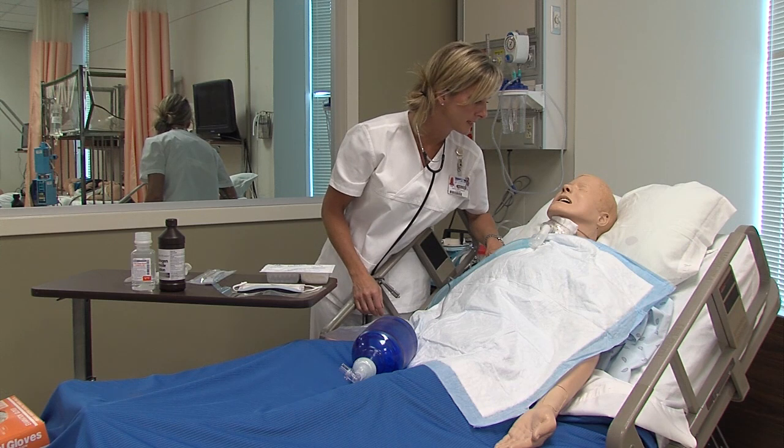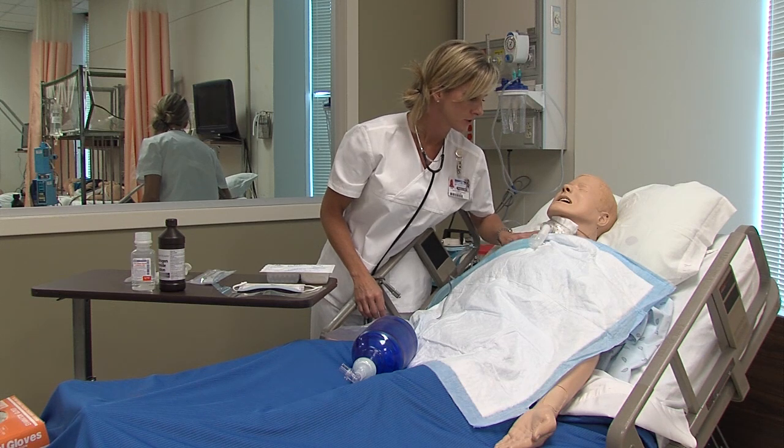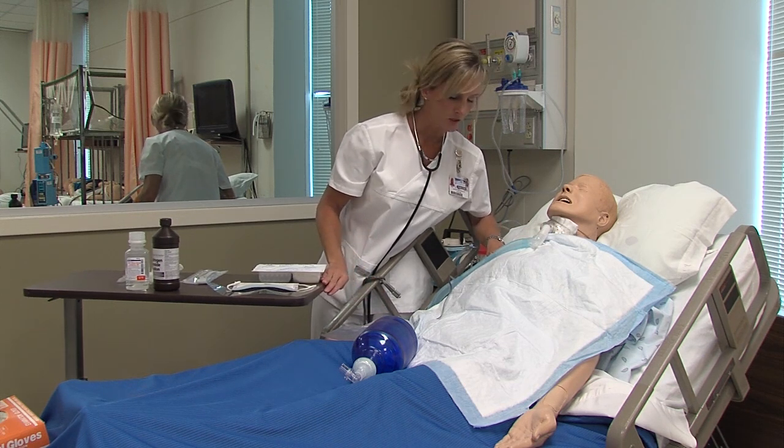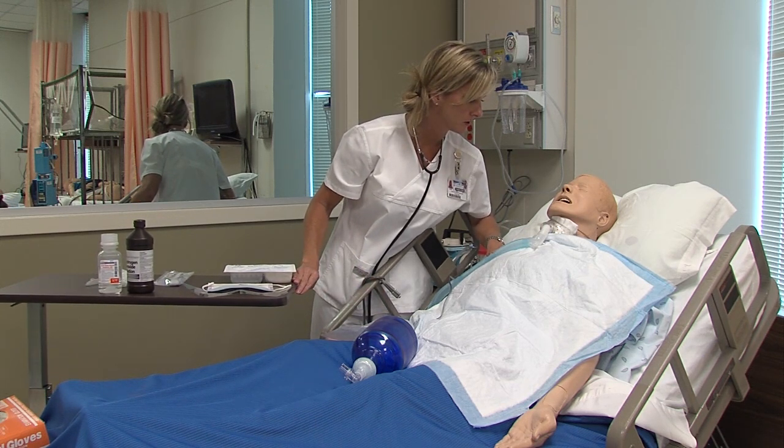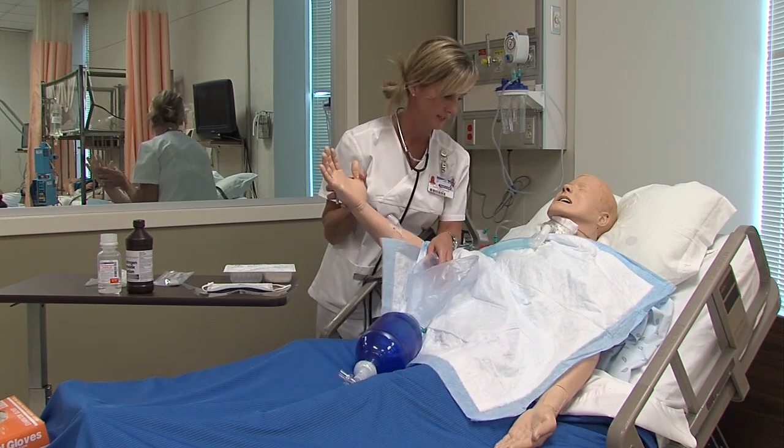Mr. Brown, my name is Annette Rigby. I'm going to be your nurse today. Right now I'm going to perform trache care on your trache. If at any time during the procedure you become uncomfortable or experience any discomfort, I need you to raise your hand for me like this.